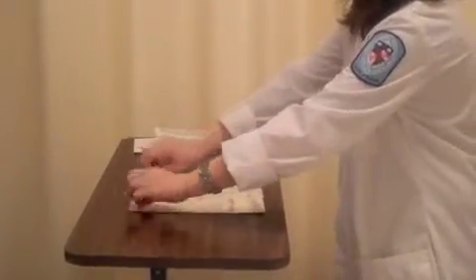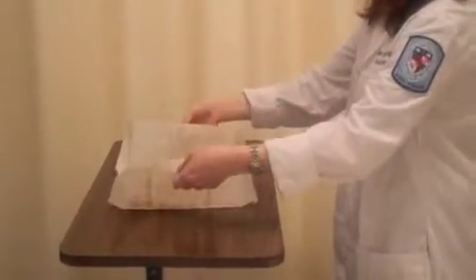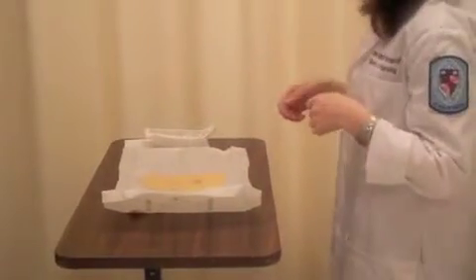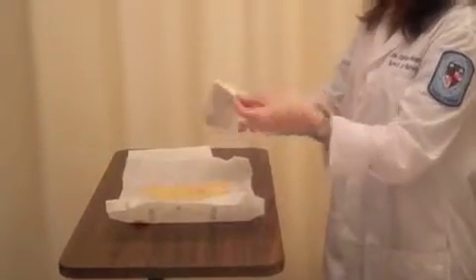Open sterile gloves and create a sterile field using sterile glove package. Open chlorhexidine swab and drop into sterile field.